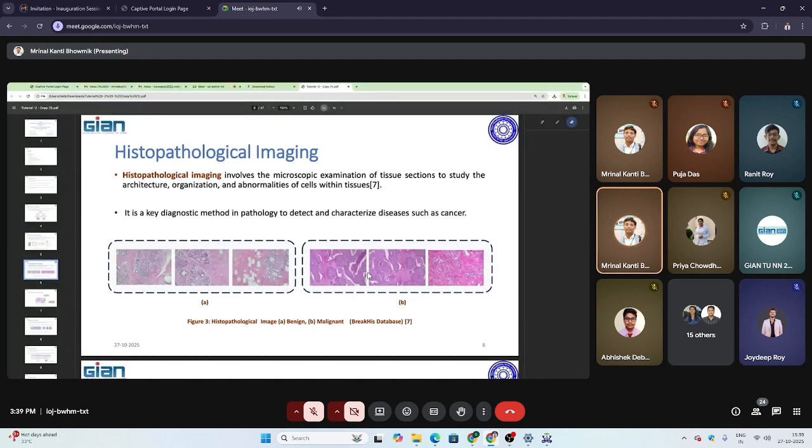Looking at this kind of data set, we can't tell which one is the cell part, which is the number of cells, which is the lump, and which is the single cell. This is standardized, and they have created their own annotated data, or ground truth data, with the normal data. So today our main motto is to create the ground truth data.